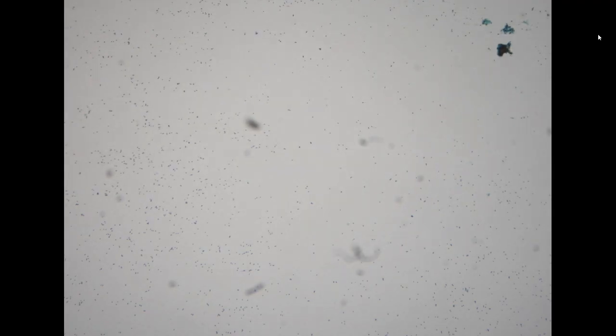The next specimen is kind of tricky. And it is one of the most challenging areas for body fluid cytology. So the patient is a 53-year-old female. She had a past history of thymus squamous cell carcinoma, so thymic carcinoma with squamous differentiation. And this is the pleural effusion from the same patient. The clinical impression is either lung metastasis or lung abscess.